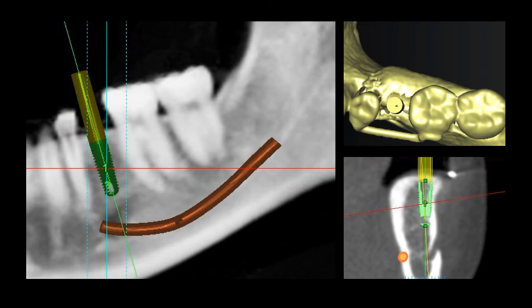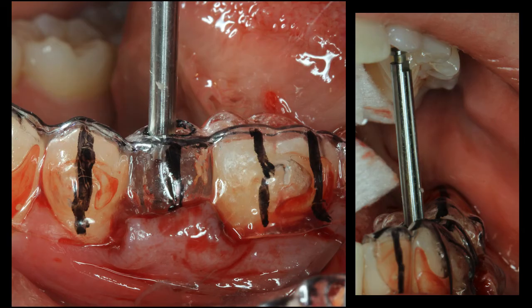Moving on, we did the clinical exam and fabricated a surgical guide. We utilized, in this case, a vacuum-formed surgical guide with lines to determine where the implant or the drills should go, with a hole in it.